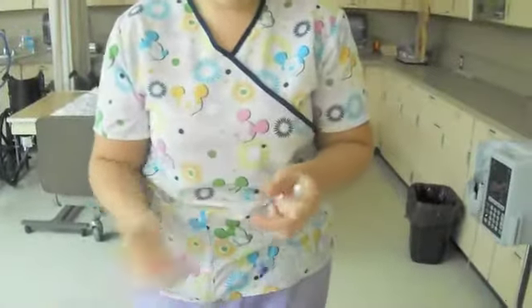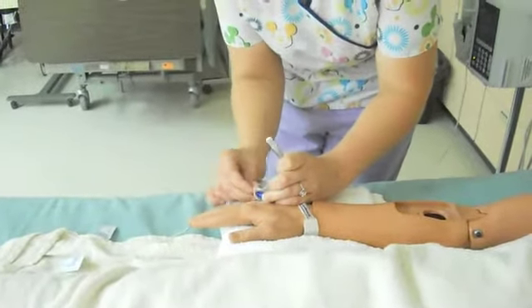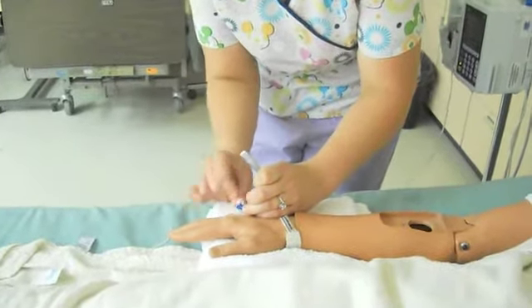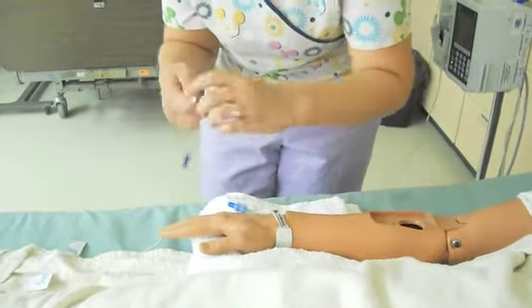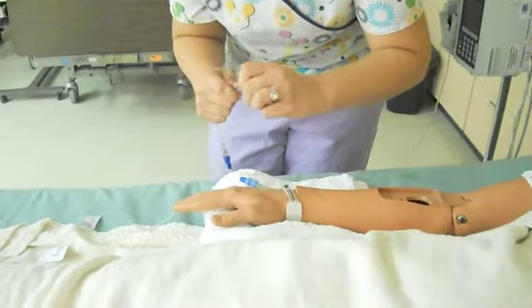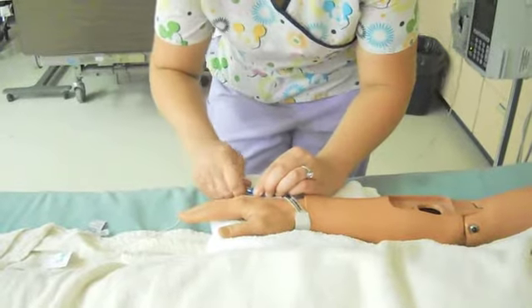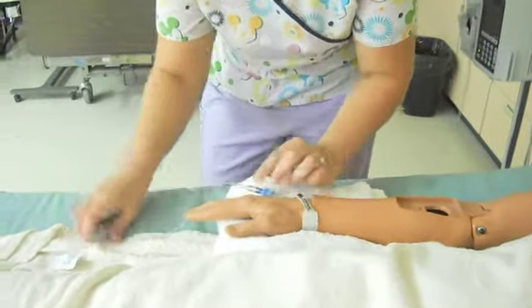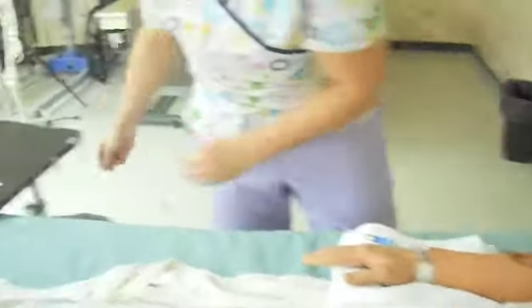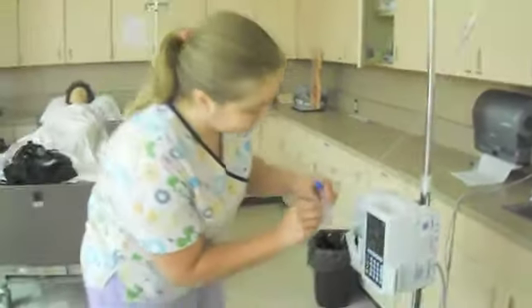So I'm going to get an alcohol swab ready and we're going to swab this port for about 15 seconds. I'm going to move this cover and connect it. Make sure you clean your area as you go.